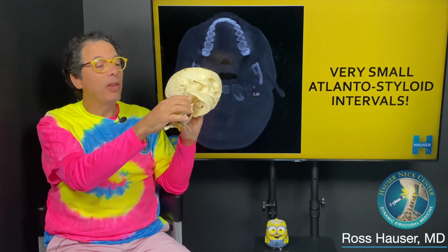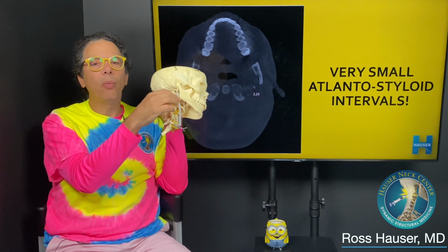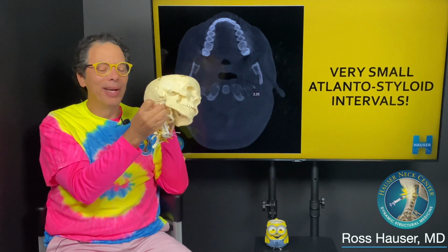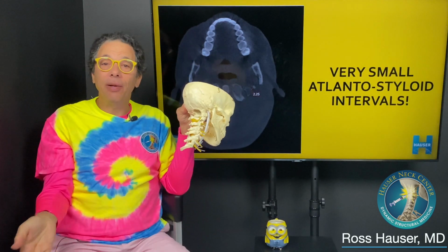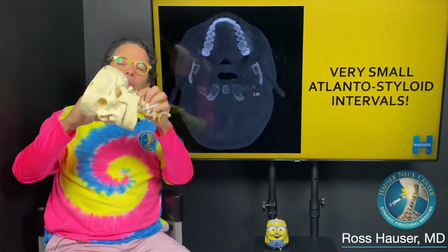But the good news is, see how his styloid bone isn't bothering him anymore. So if the styloid bone was compressing Eddie's jugular vein, here Izzy's cracking up, like, oh my God. But some people need a styloidectomy. So I just did a styloidectomy on Eddie. Like you saw it live, what could be better? Okay, so we'll go to the other side.